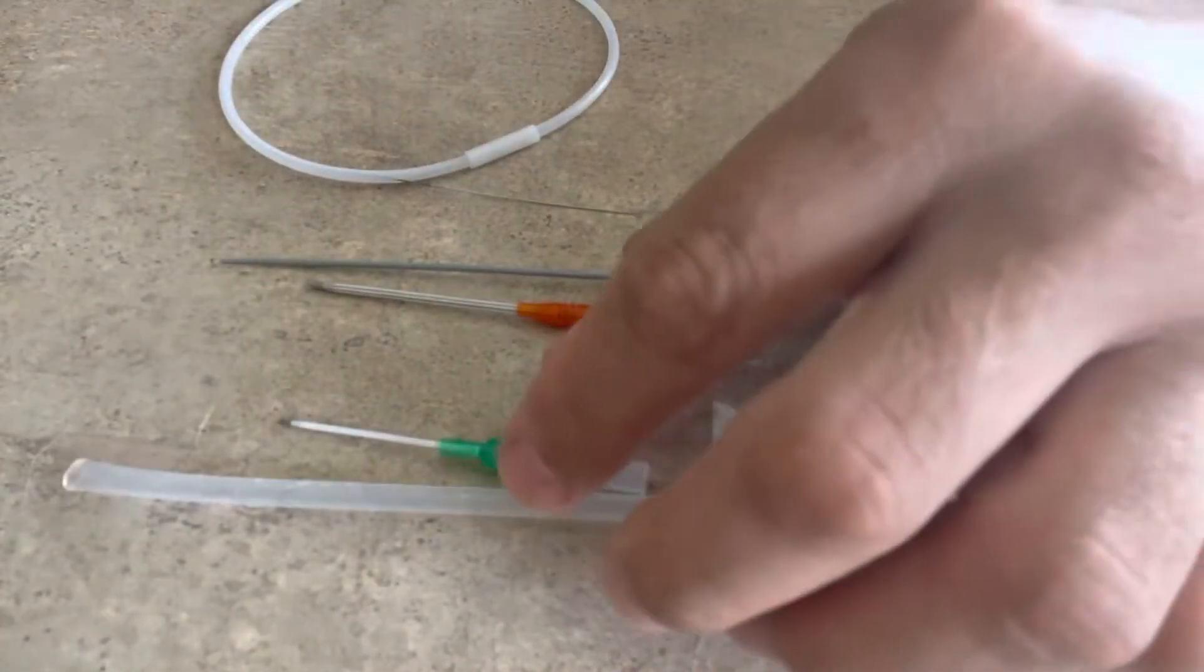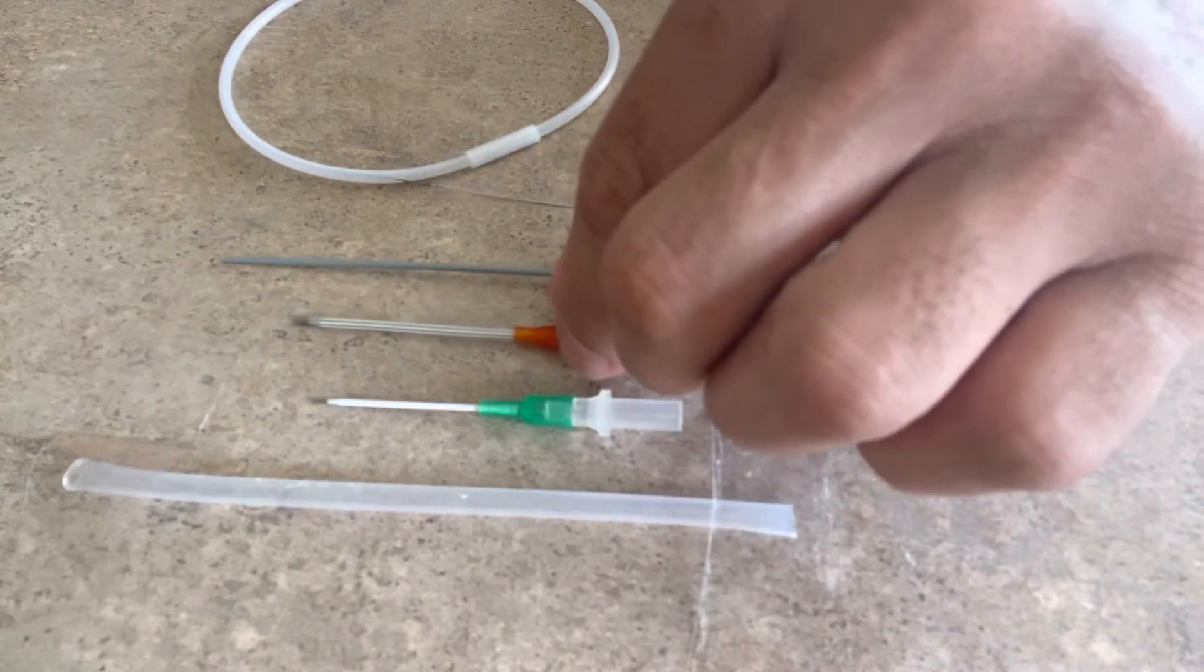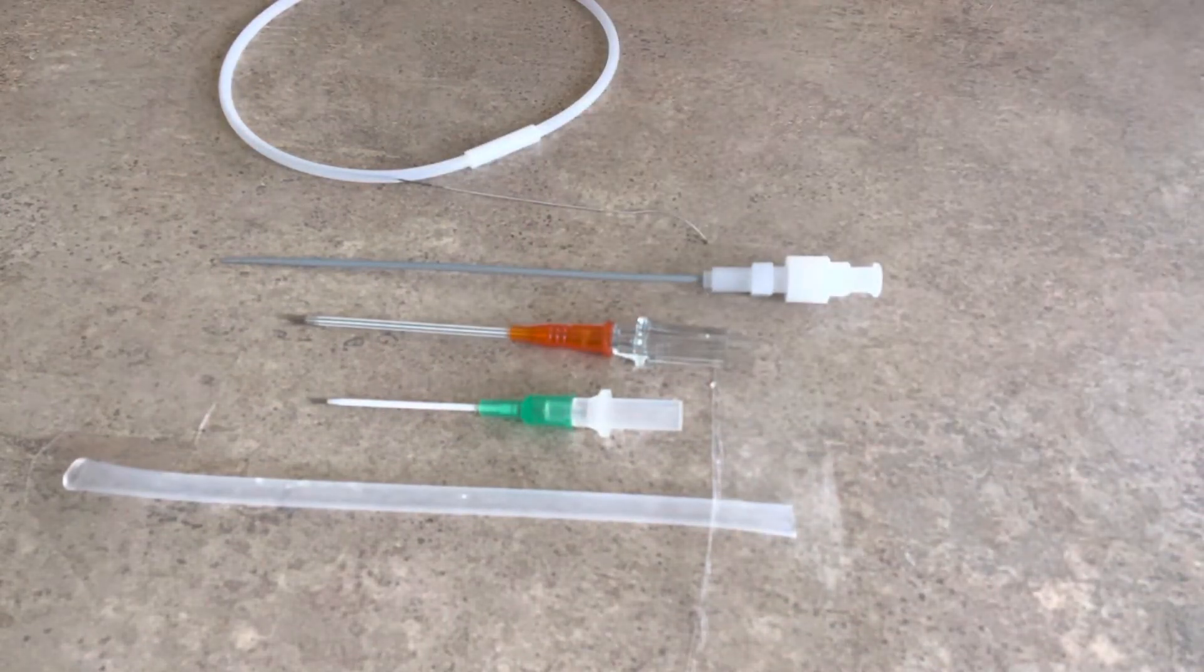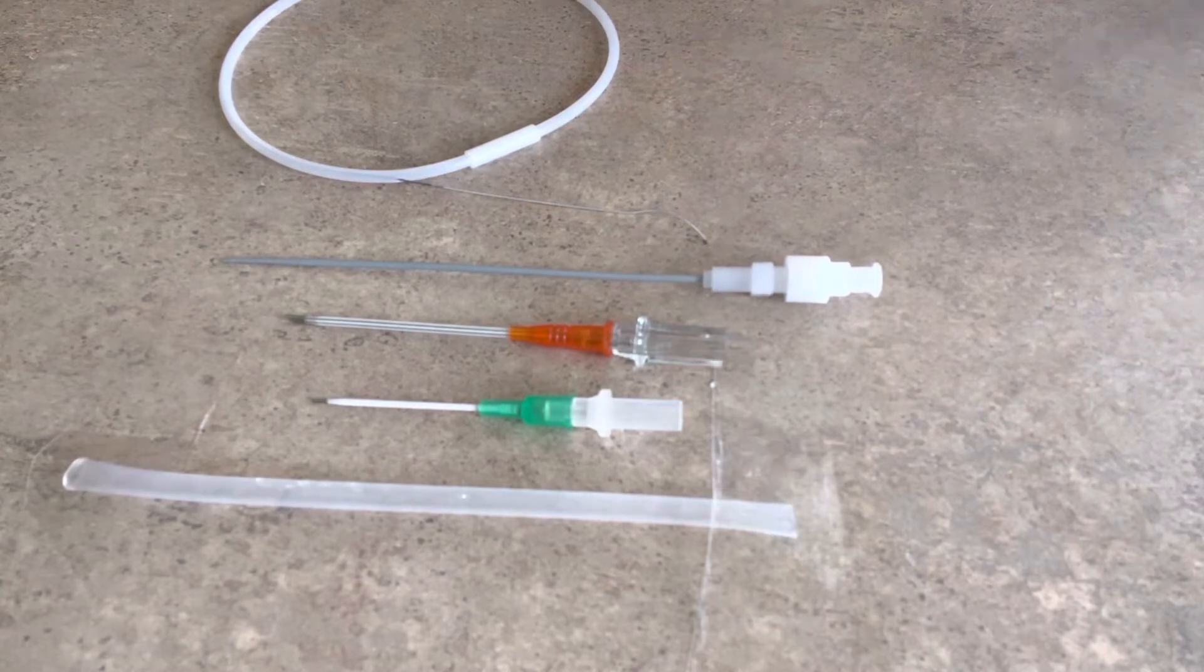And this is what I took out of the kit. And so this technique can be used either for rewiring an existing IV, or if you start an IV like I'm going to do right now.